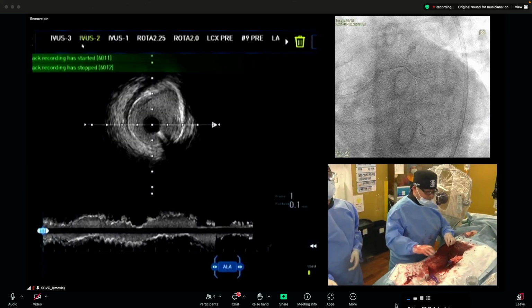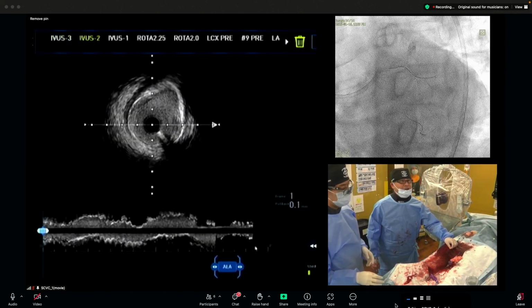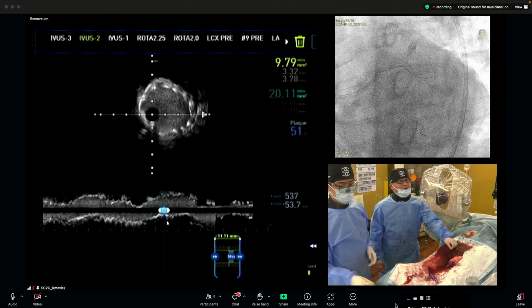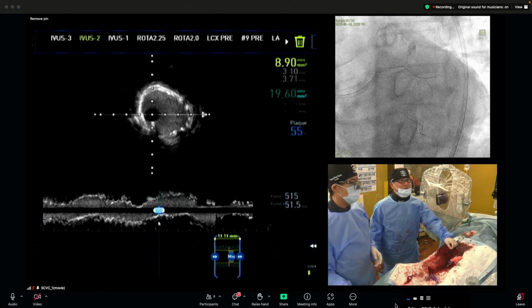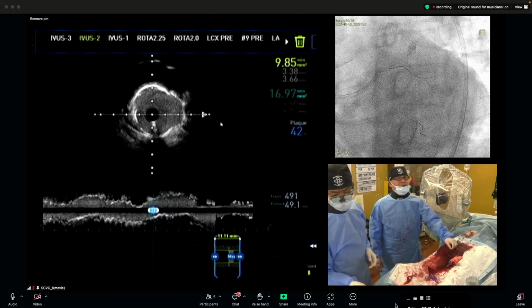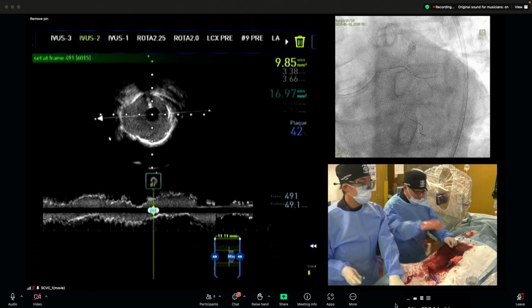Okay, sure. Yes. So after this IVUS imaging, I don't like the images in the middle of the LAD. This part is asymmetric, with an eccentricity index less than 0.7. So after the proximal POT, I will make much more dilatation with high pressure for that region.